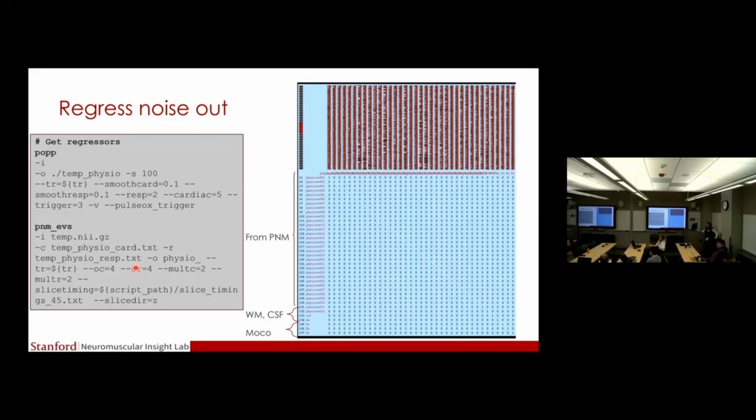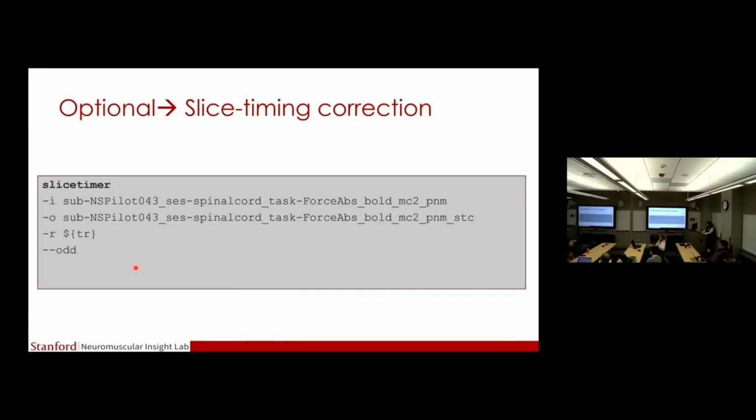That's a very interesting result to report in the publication, because people are wondering. I think one of the reviewers asked, and I think you added it already to the publication, right? To add the result, it was not in the entire report. Oh, I see, okay. But we justified it. Okay, so that was this data? Yeah, this data. But I still have the results.